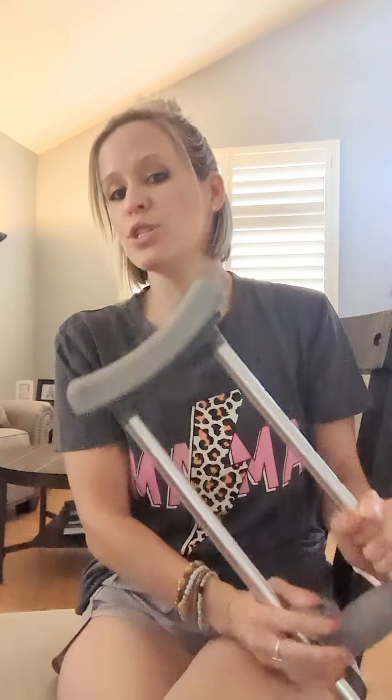What I find frustrating about crutches sometimes is that I don't have any free hands to be able to hold or carry anything. So I've been working on getting better with the one crutch. I'm going to show you some tips for how to appropriately use one crutch. Before you want to do something like this, you want to make sure that you have enough stability and that you're cleared to go down to one crutch versus two.